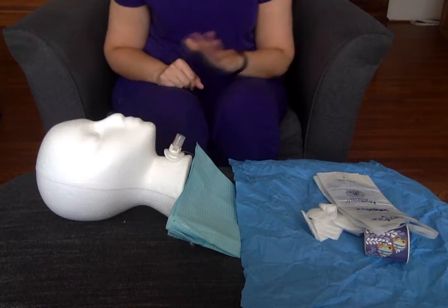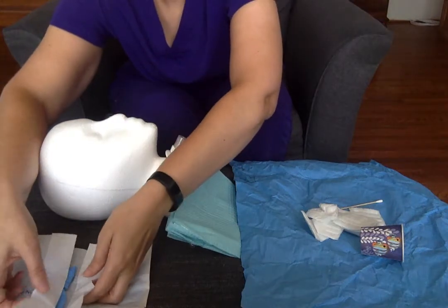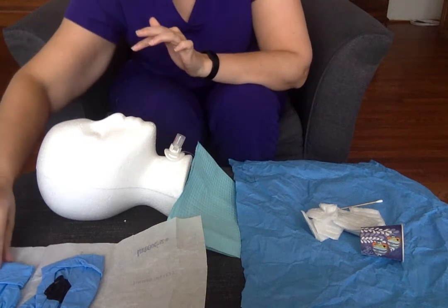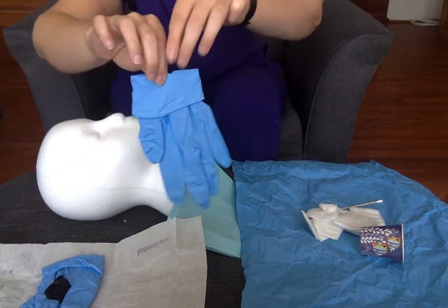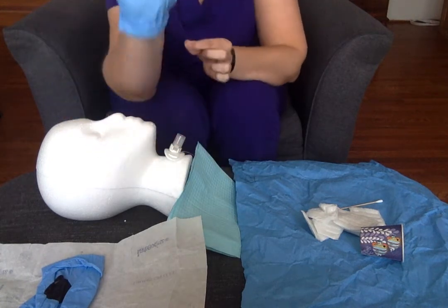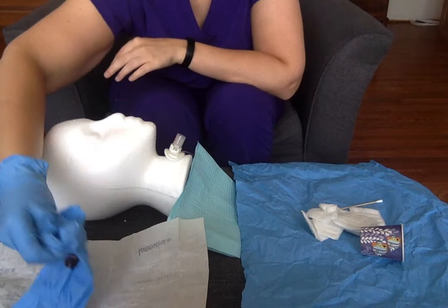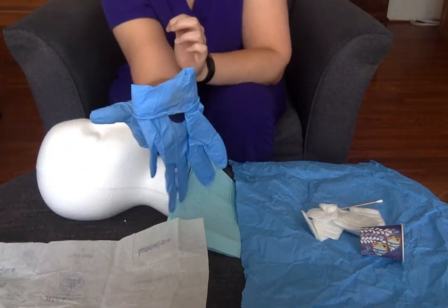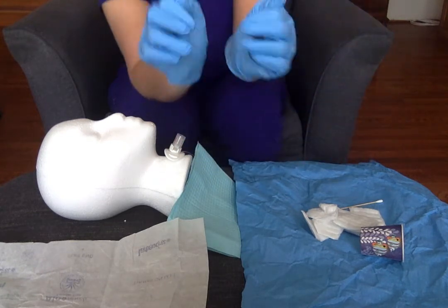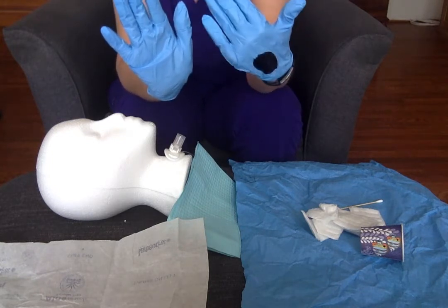The next thing I would do is grab my sterile gloves. Remember, you can only touch the one-inch border of the package — it's considered dirty. I can pick up my glove by the inner cuff and slide my hand in. Remember, you can't go back and touch the outside part of this cuff to fix it; if you don't like how it went on, just leave it. I'm going to put my fingers inside the cuff and keep my thumb away from me as I slide this one on. For a visual reference, I'm going to have a sterile hand and this will eventually become my dirty hand.